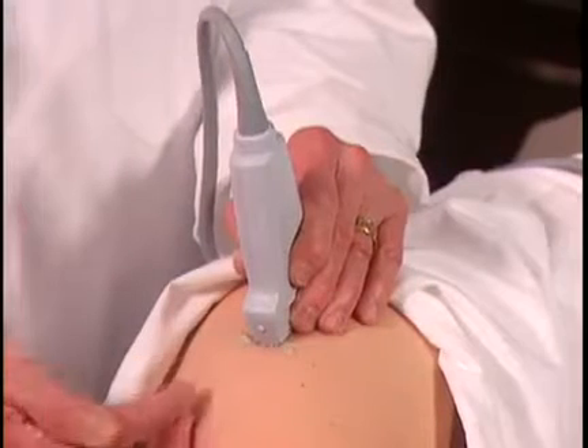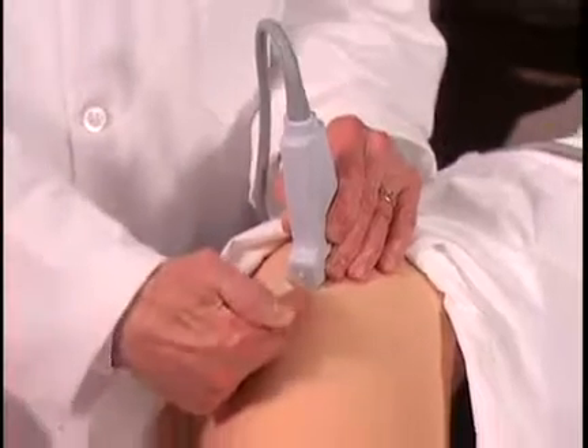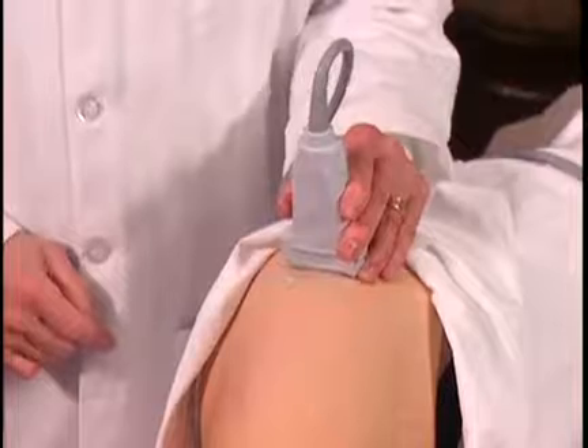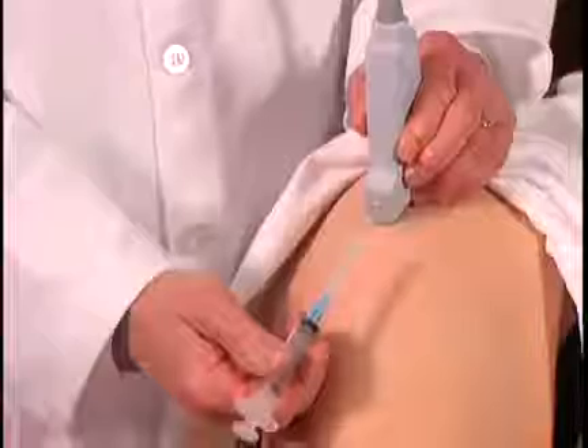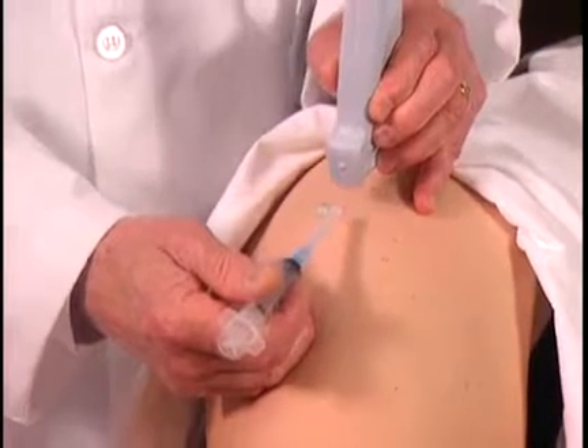This injection could be performed with the transducer in a longitudinal position, coming in this way, or could be done transversely with the transducer in this position. I'm using an in-plane approach — the needle and the syringe are parallel to the direction of the transducer.